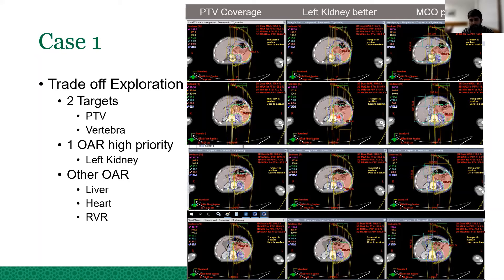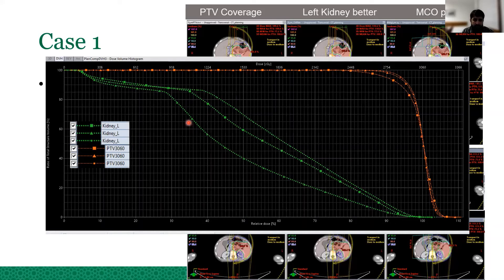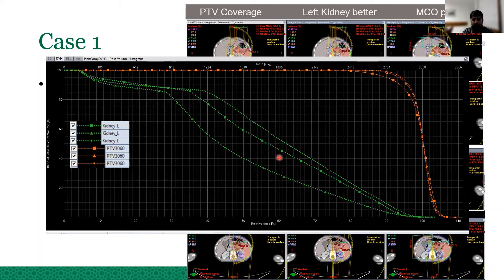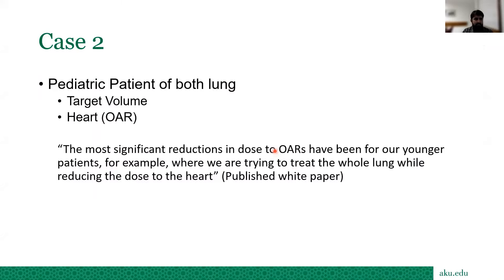When I tried to reduce the dose to the kidney, the dose to the PTV also reduced — you can see the blue 50% isodose line is more confined. The MCO plan gives a sharp dose fall-off, which you can appreciate here and also in the DVH. The MCO plan achieves good PTV coverage while reducing kidney dose by around 22 percent. The liver shows no significant difference between plans since it is not close to the PTV.